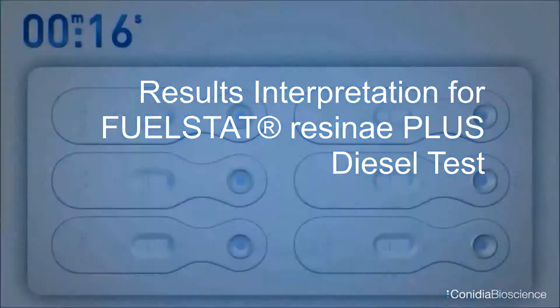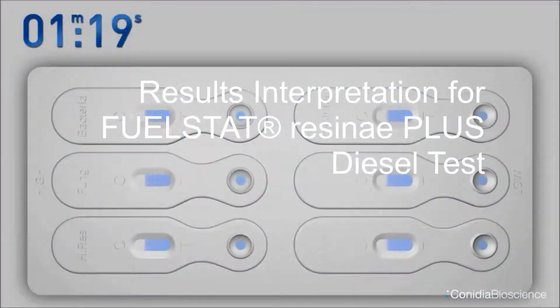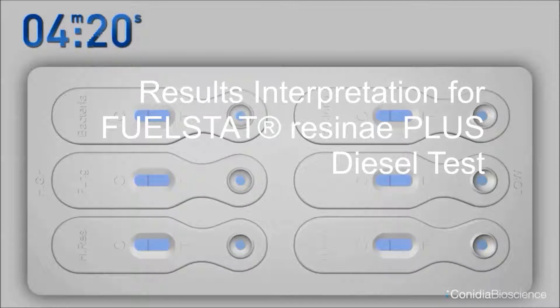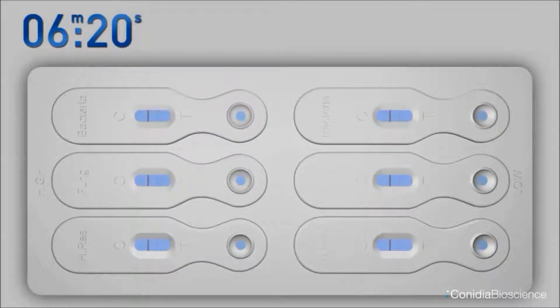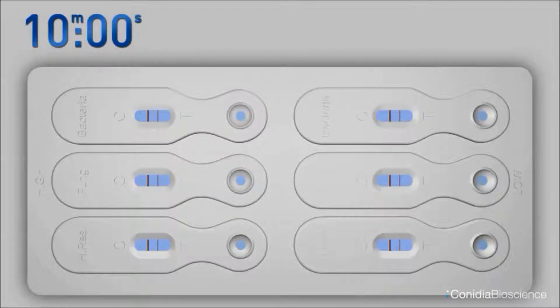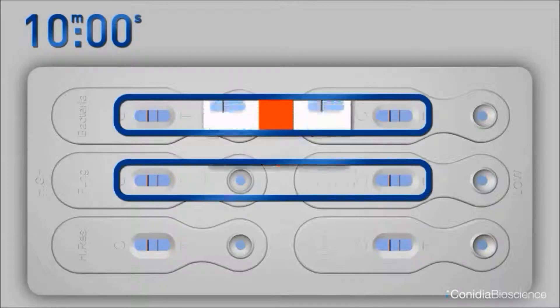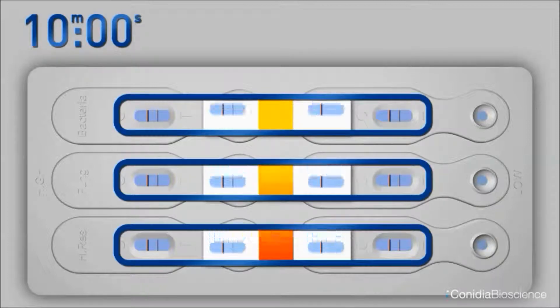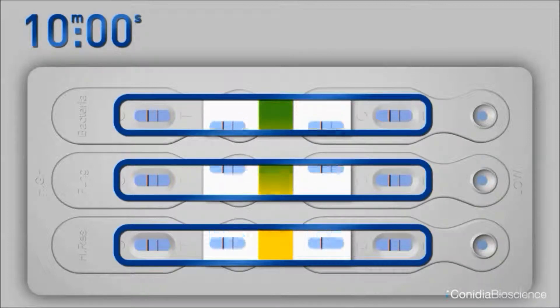Red lines will be seen to appear in the viewing window adjacent to the embossed C on the device. These are the control lines which indicate the test has activated. It is the appearance or otherwise of the faint test lines adjacent to the embossed T on the device which indicates the result.